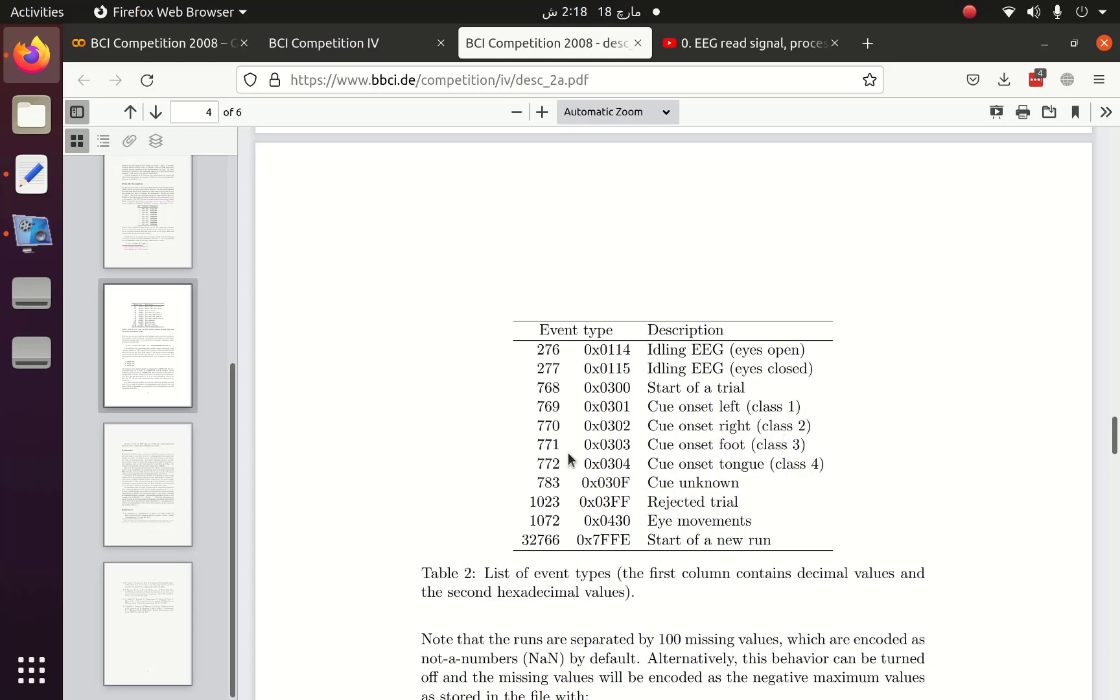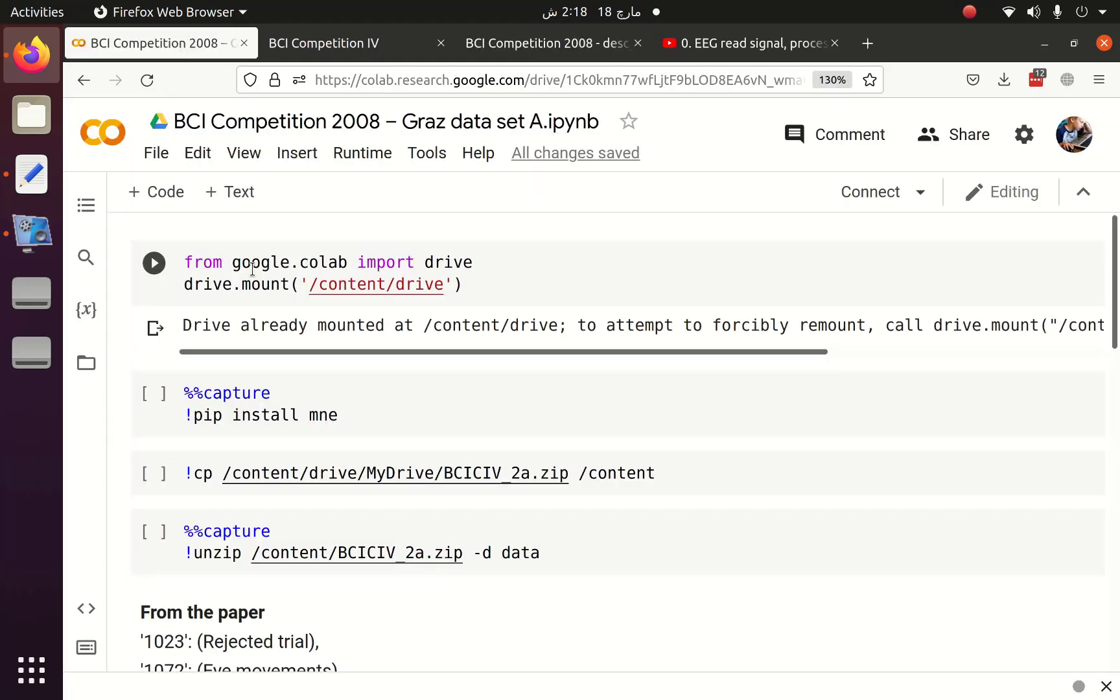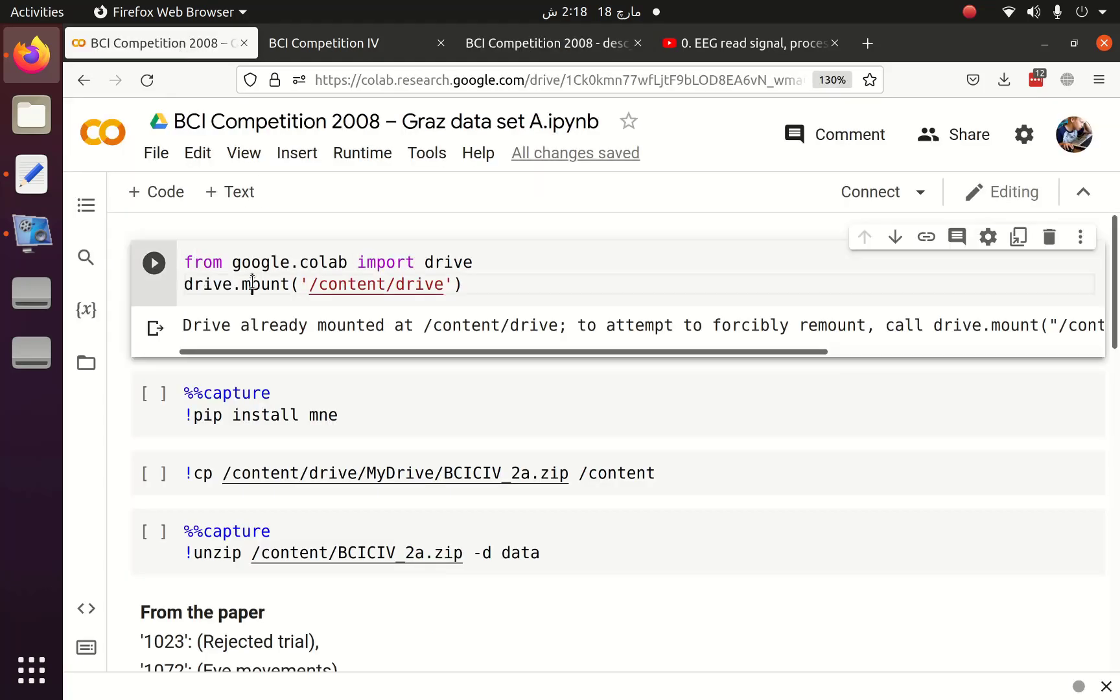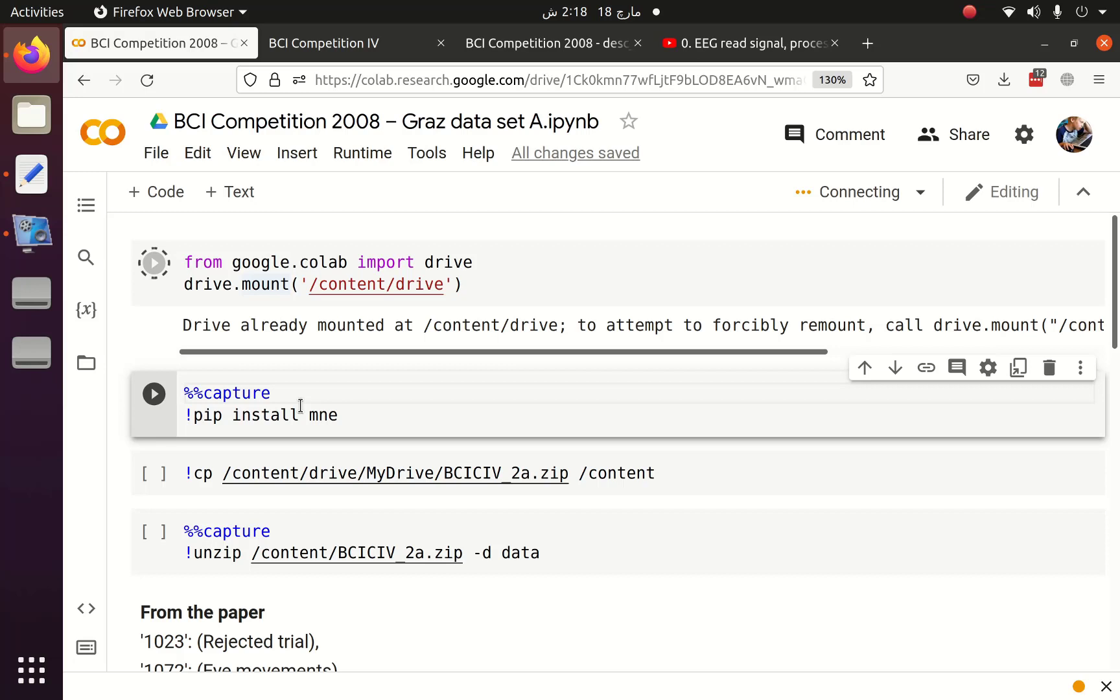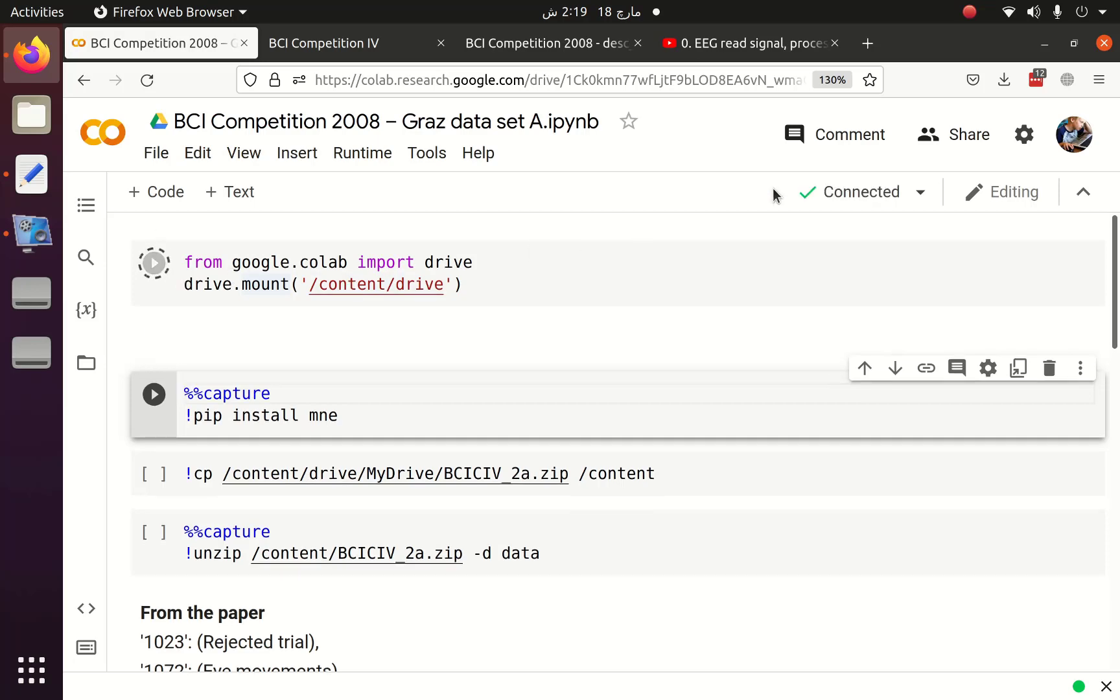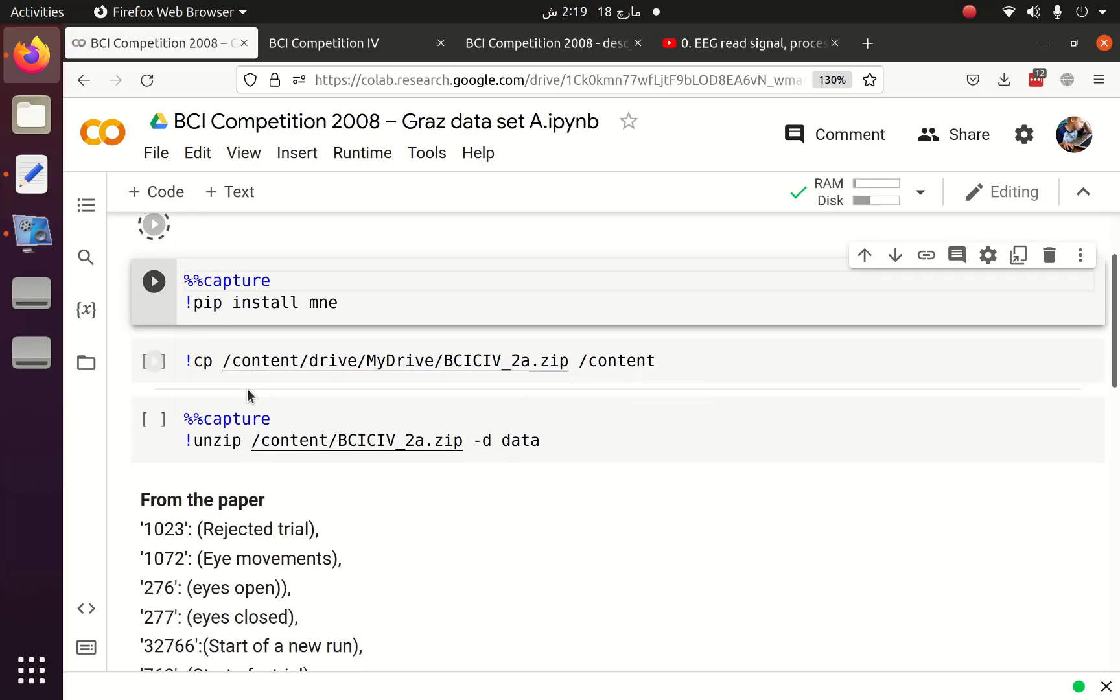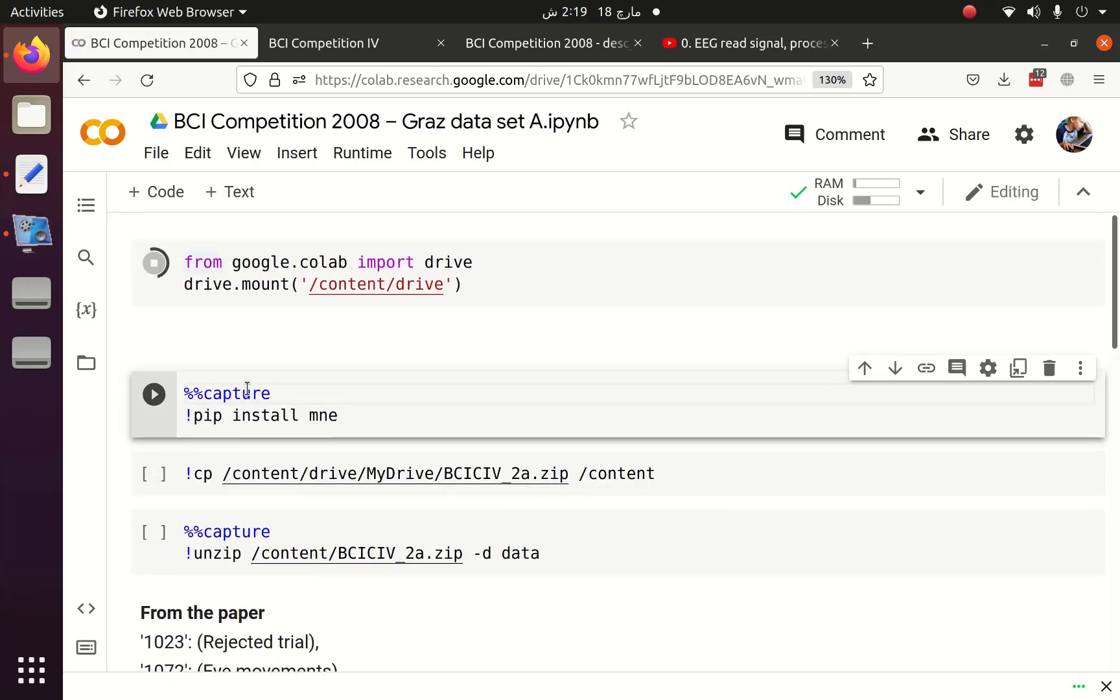So let's start with the dataset. I have uploaded the dataset in my Google Drive. I am going to mount the Google Drive with my Google Colab, and after that I will install MNE package which we are going to use for handling EEG data. That will take some time to mount and initialize. After that we will see what we can do.